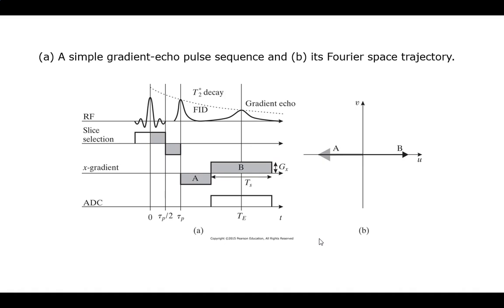Now at the end of this, I've got all of them with that slight perturbation going the other way. So they're back here frequency-wise because I've reversed them. If I was originally fast here and slow here to read down, now I'm reversed. I'm fast-slow instead of slow-fast.